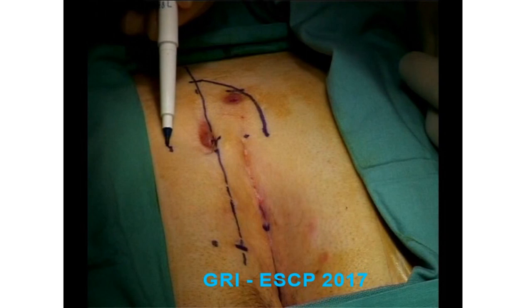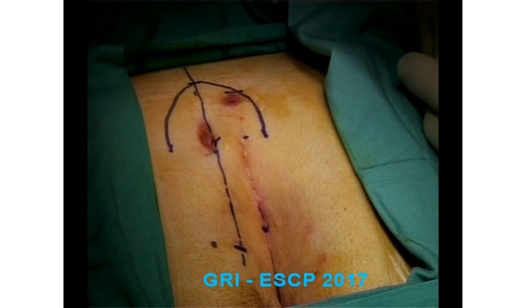Any nearby secondary fistulae are excised, but distant ones are left in situ, as these will self-heal.